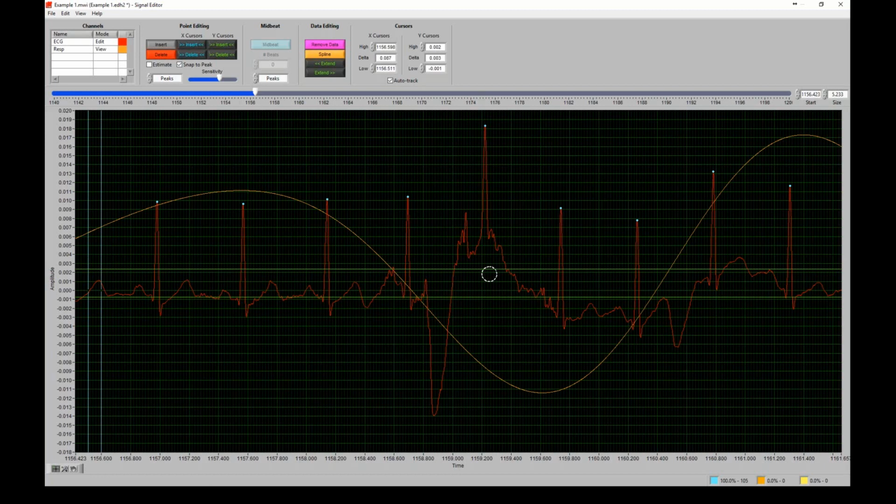It's only when we're estimating, when we're really making our best educated guess as to where a beat may have occurred, that we have to consider how many of them we've made. But you can do as many of these sort of edits as you'd like without any concern.